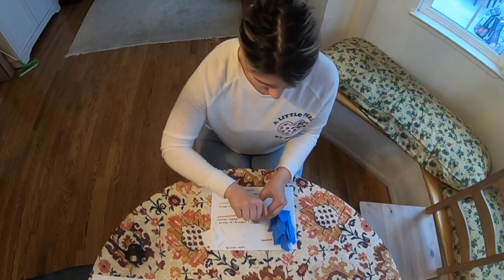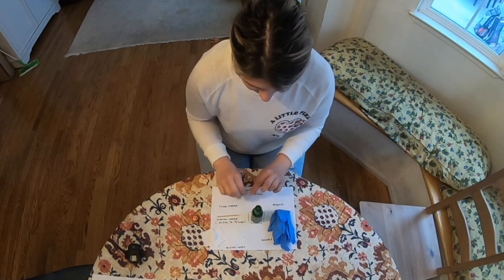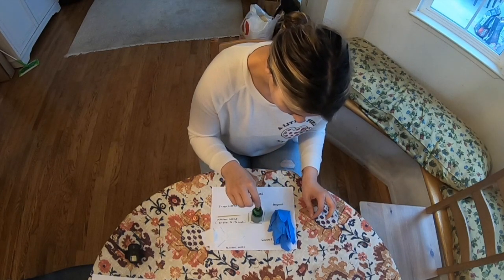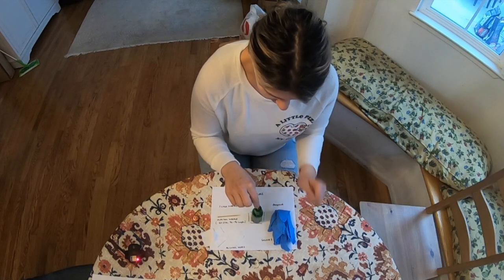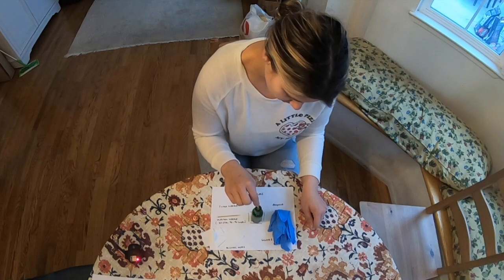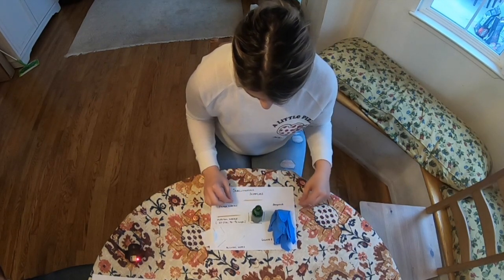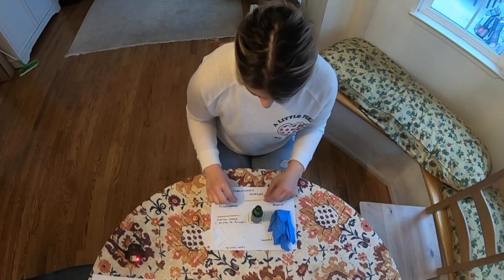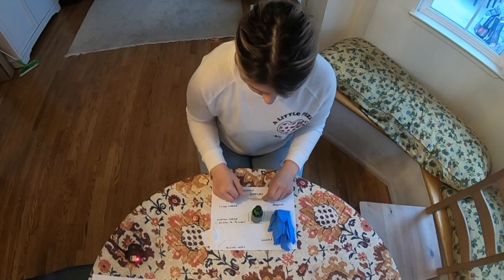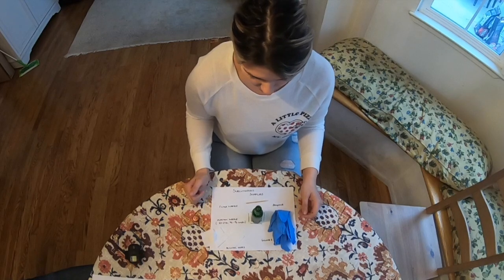You'll then have your filter needle attached to a syringe, stick it in, and draw up with your filter needle the amount that you need. Take it out, technically recap in a safe way, remove the first filter needle, apply the next needle on, and then you'd be ready for your injection.